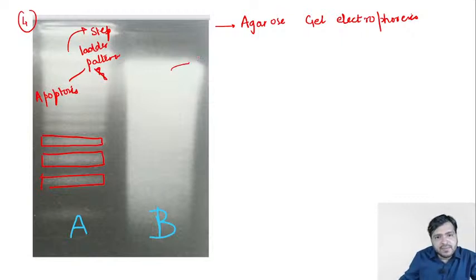And the smearing pattern, just like a smear, is seen in necrosis.